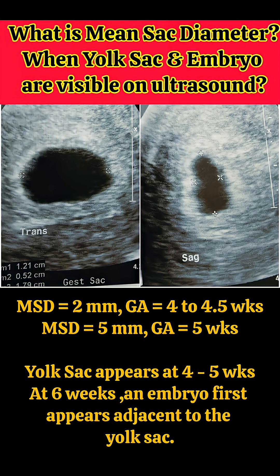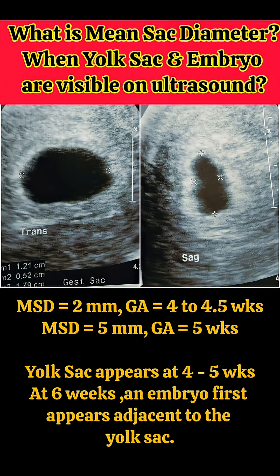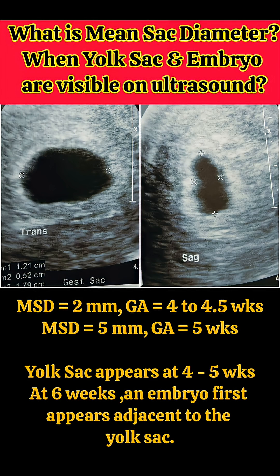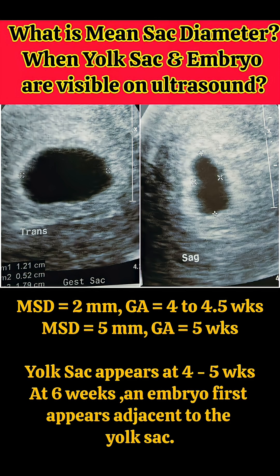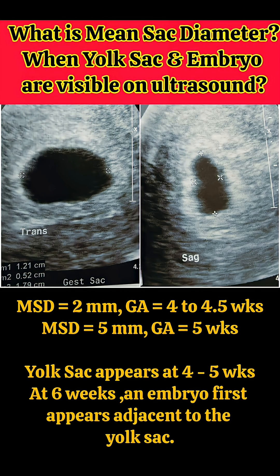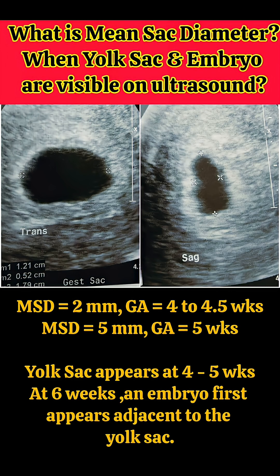At 6 weeks, an embryo first appears adjacent to the yolk sac. When the embryo is first seen, cardiac activity is appreciated as a consistent flicker. Once the embryonic pole is visualized just before 6 weeks, measurement of the crown-rump length of the embryo is considered the most accurate method to date the pregnancy.